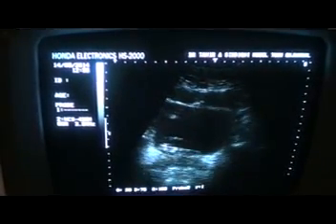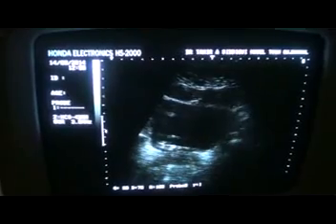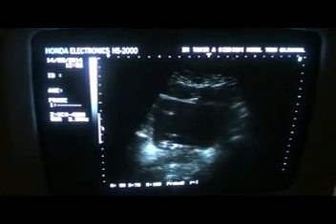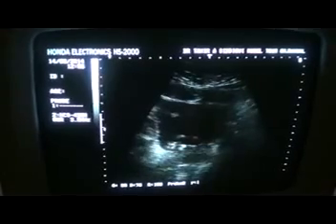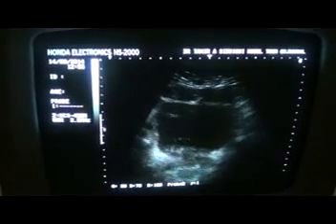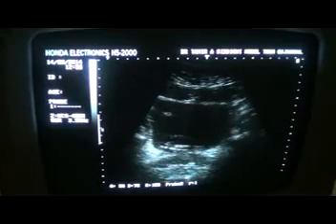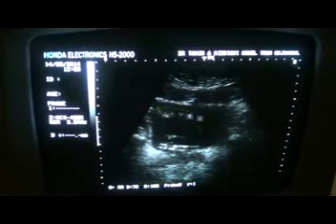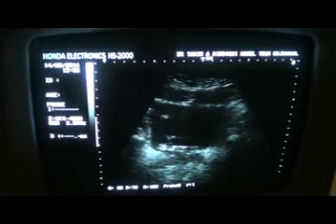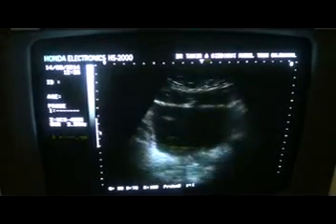Now this is an ultrasound study of a 38 years old young man with the complaint of KUB. He presented to me for ultrasound last week, had a procedure performed in which a stent has been placed, and we can see that this is the urinary bladder, and this linear structure that you are seeing within the lumen of the urinary bladder is the stent which is patent in transverse section.